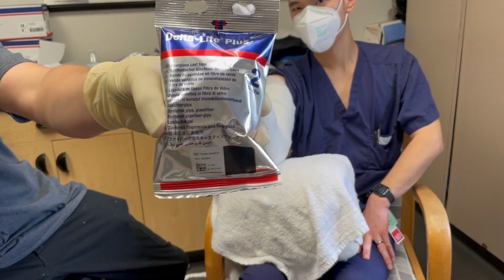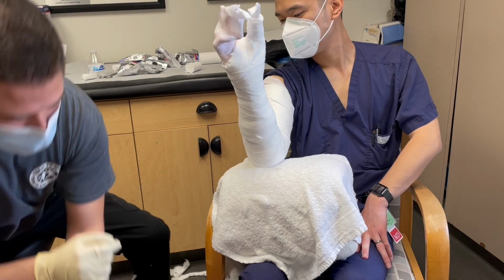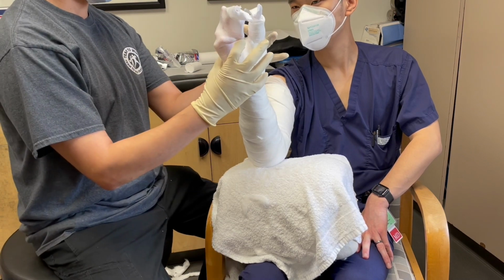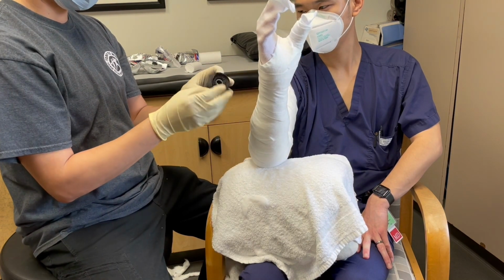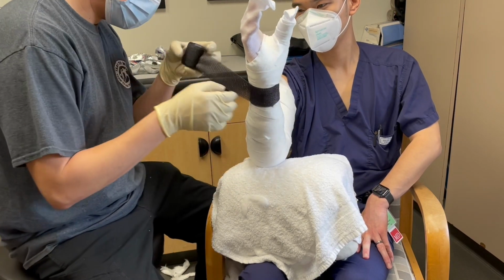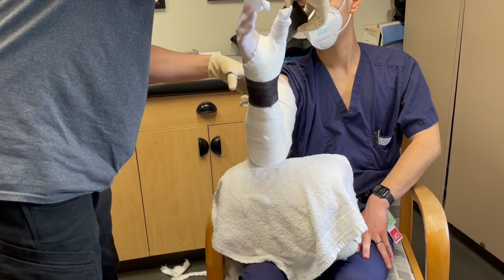We're going to start with a 2-inch fiberglass tape. Remember to submerge the fiberglass tape with cool water. We start here at the wrist and work distally towards the thumb. The layers are overlapping 50% of the last layer.